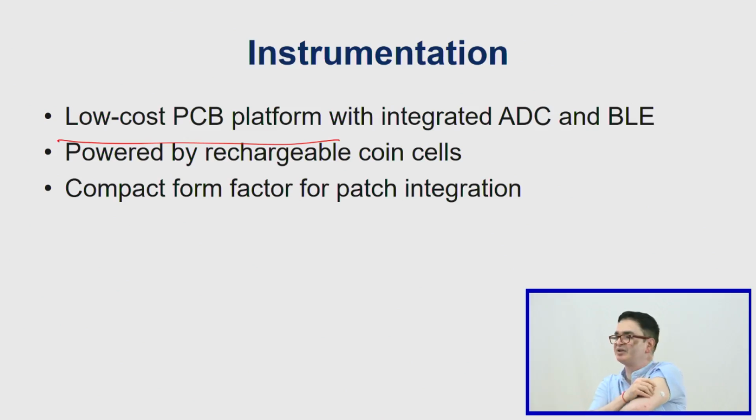These devices have evolved over different generations, you've had generation 1, generation 2, generation 3. This is Freestyle Libre 3. Look how they've miniaturized it, and everything is in this particular disc here. We will show you tomorrow one of those devices that have been removed, and we will show you the tiny little components they have on the PCB that's in here. And this has also got the facility to store data. So if I lose the connection, all the data is stored in this device, and when it gets the next Bluetooth connection, it then connects to the Bluetooth as well. Up to 8 hours, right?